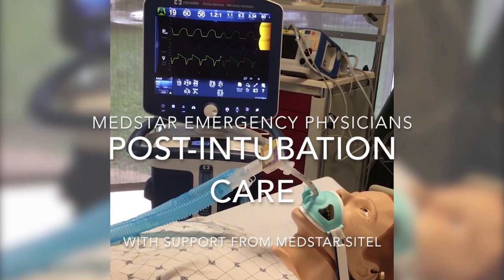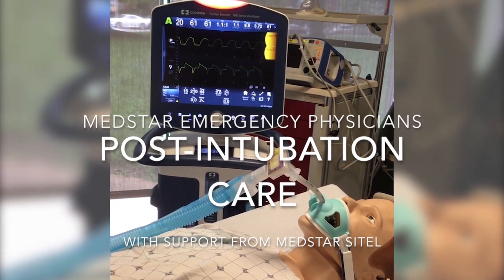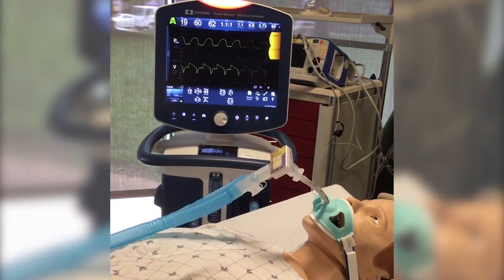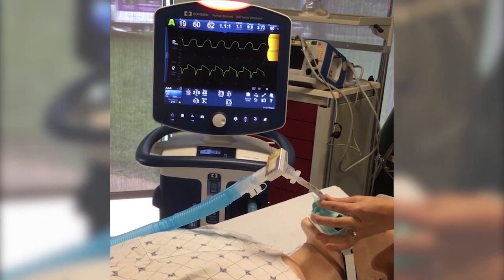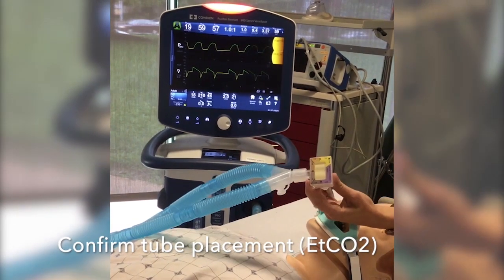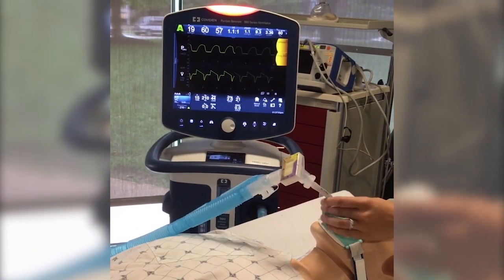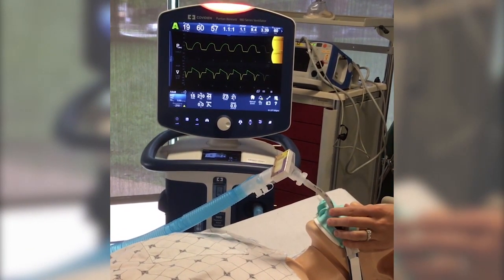After you've successfully passed the tube, there are several things that should be done to ensure successful post-intubation care. To begin, verify placement while holding the tube secure. Listen for breath sounds while you bag the patient, and look for color change on the colorimetric CO2 changer, or check the monitor for an appropriate end tidal CO2, which is around 30.